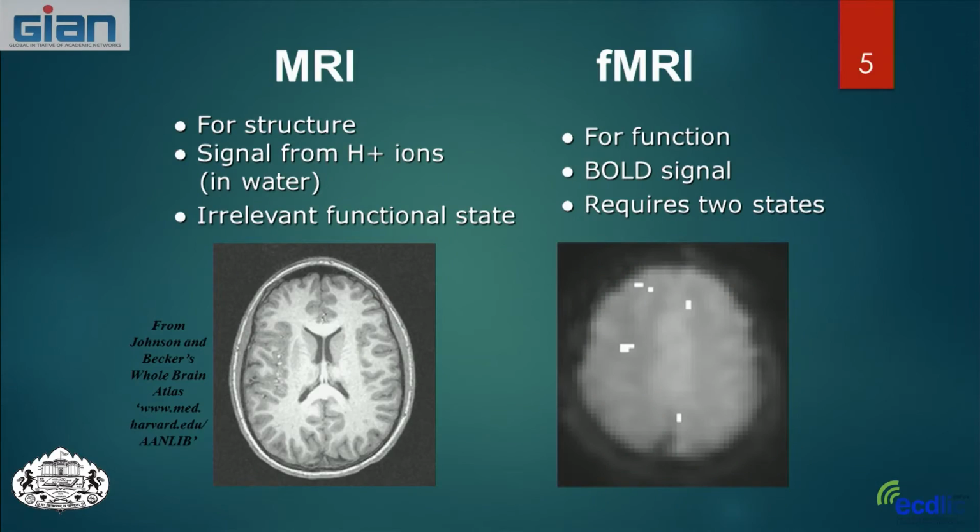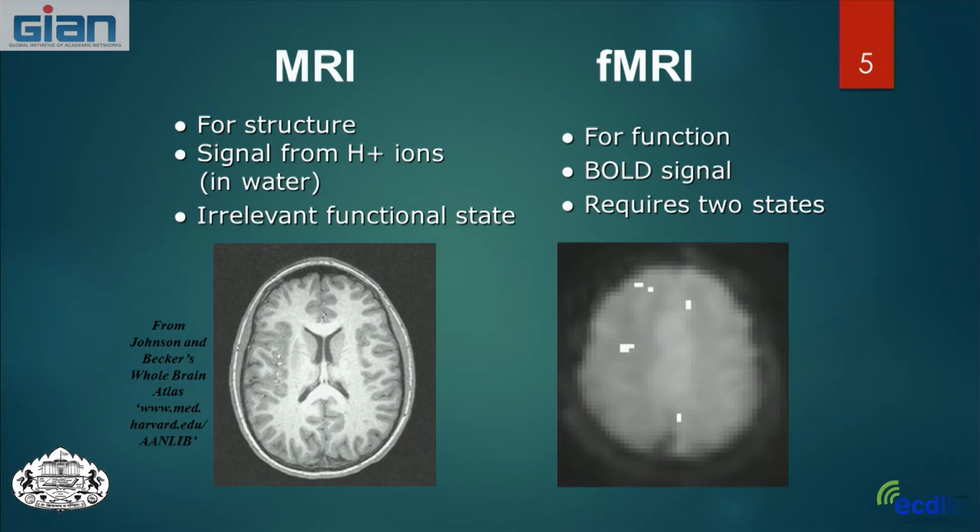But you can see here on the screen the extreme difference in the resolution of these images. So in our MRI image, those are typically collected over a longer period of time. A scan of this type might take about 7 minutes to complete from start to finish, whereas in functional MRI, we also may have a 7-minute scan, but we're collecting bold information and we're collecting it very quickly. So you can see that the resolution drops dramatically in these scans. So it's a trade-off between how quickly you want to scan and how much resolution you want to get in your image.